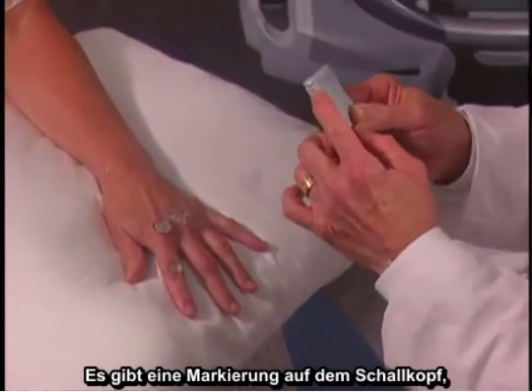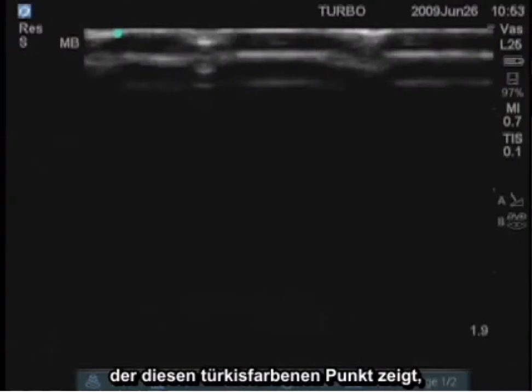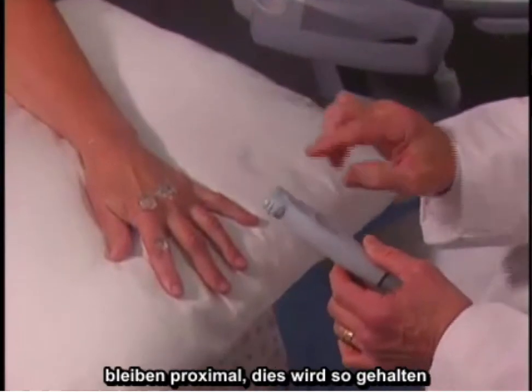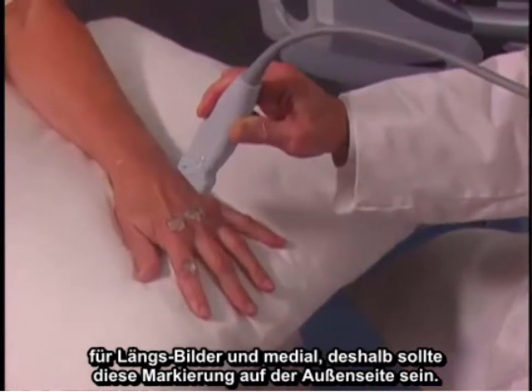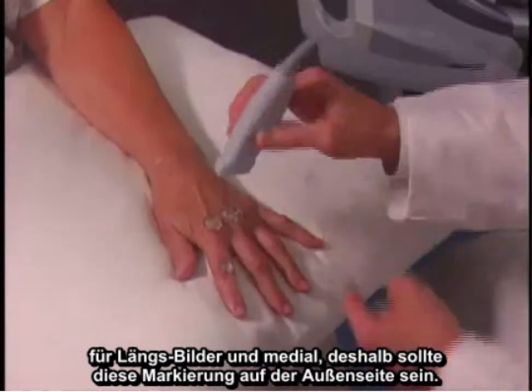There is a marker on the transducer, which represents this turquoise dot. In keeping your orientation straight, you always want to keep this proximal, so this is held that way for longitudinal images, and medial — so this marker should be on the outside.